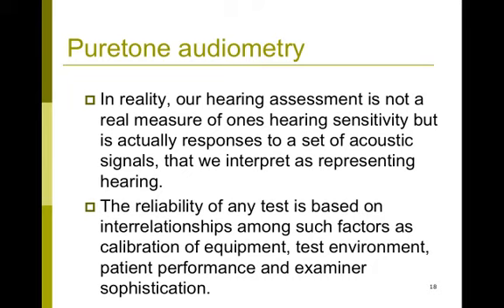Okay. So the reliability of any testing we do is going to be based on the interrelationships between these variables, which include how well calibrated our equipment is, where we're doing this testing, the patient's participation and performance, and how experienced the tester is.